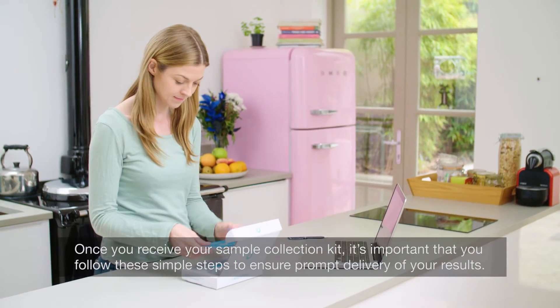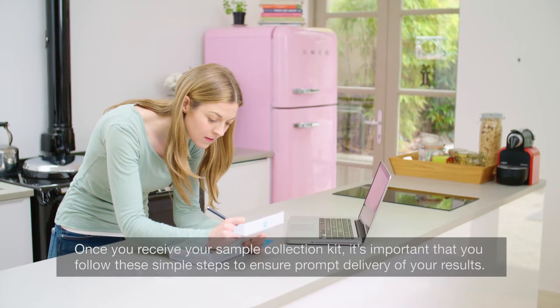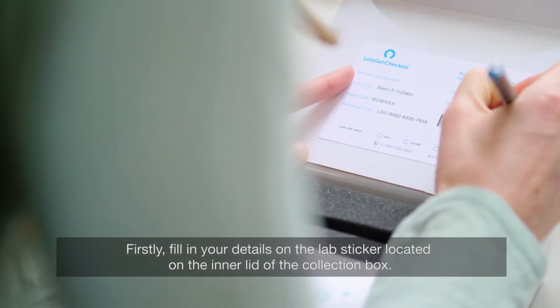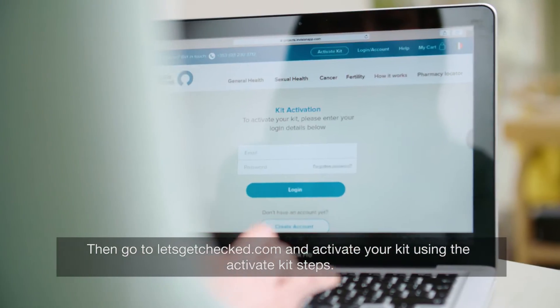Once you receive your sample collection kit, it's important that you follow these simple steps to ensure prompt delivery of your results. Firstly, fill in your details on the lab sticker located on the inner lid of the collection box. Then go to letsgetchecked.com and activate your kit using the activate kit steps.